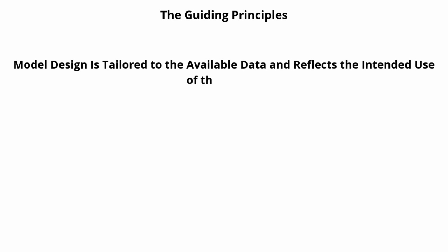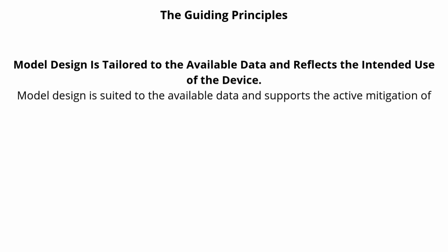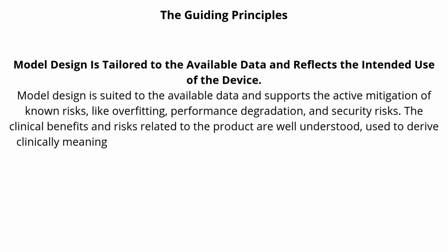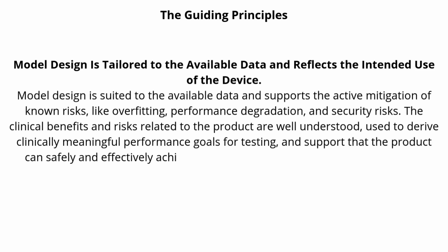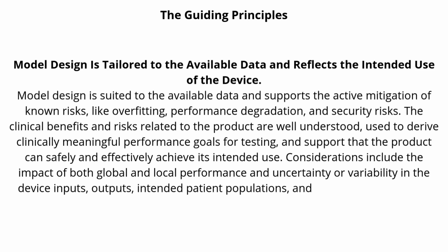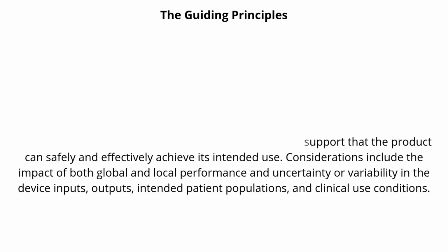Model design is tailored to the available data and reflects the intended use of the device. Model design is suited to the available data and supports the active mitigation of known risks, like overfitting, performance degradation, and security risks. The clinical benefits and risks related to the product are well understood, used to derive clinically meaningful performance goals for testing, and support that the product can safely and effectively achieve its intended use. Considerations include the impact of both global and local performance and uncertainty or variability in the device inputs, outputs, intended patient populations, and clinical use conditions.